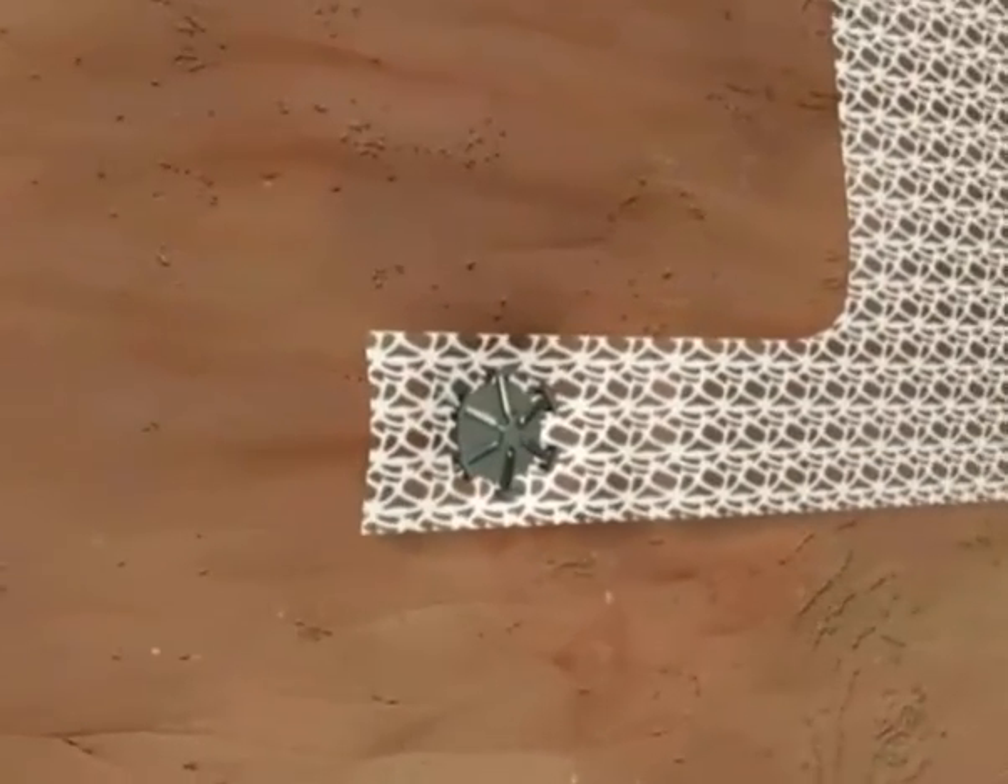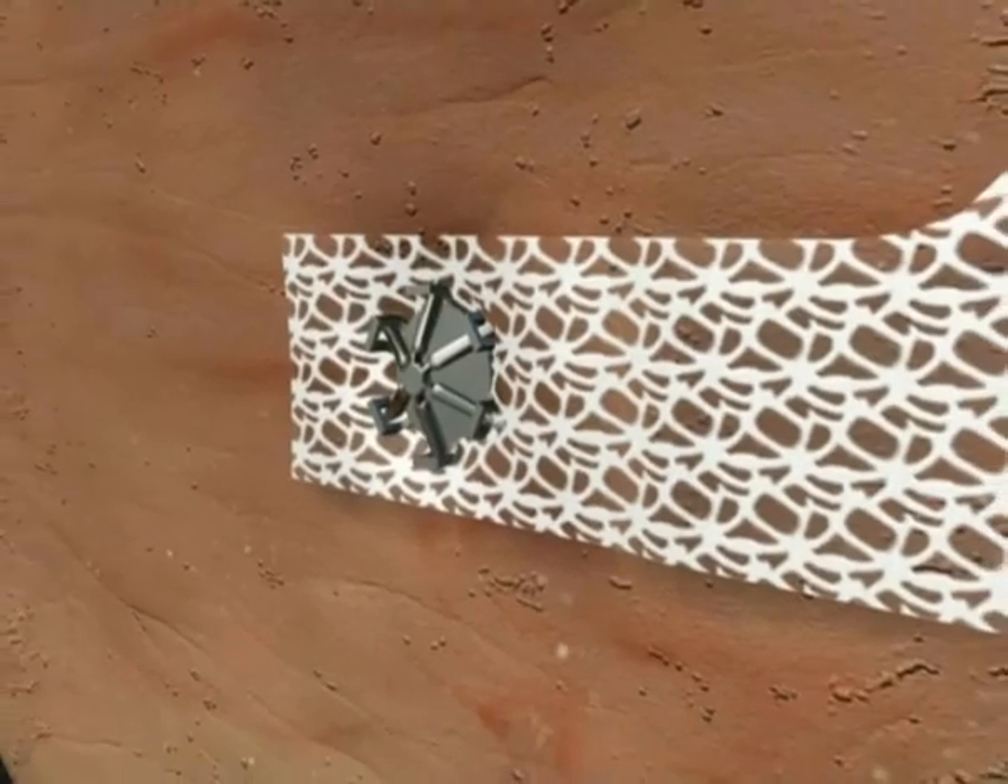The superficial attachment, two millimeters in depth, prevents potential visceral damage.